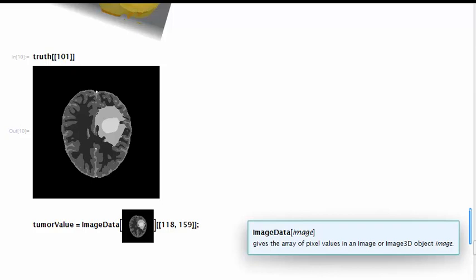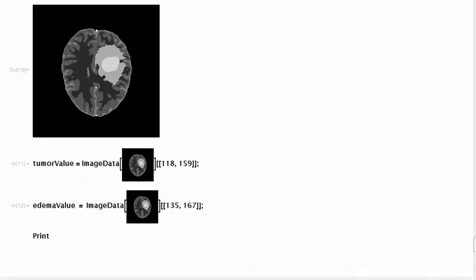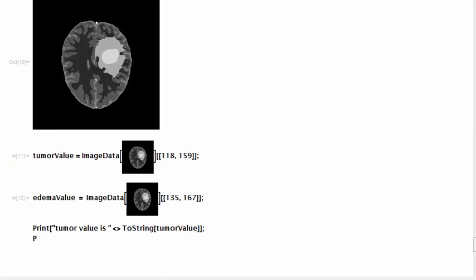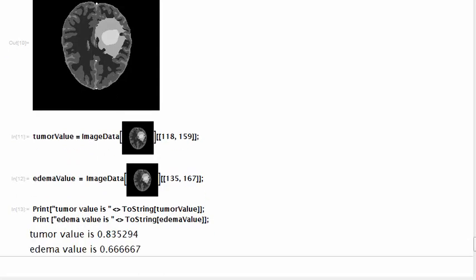The gray level that we read with the coordinates tool was a byte integer. However, the gray level that we read using image data is a float between zero and one. You can check that these float values are equal to the gray levels found with the coordinates tool if you divide the byte integer values by 255.